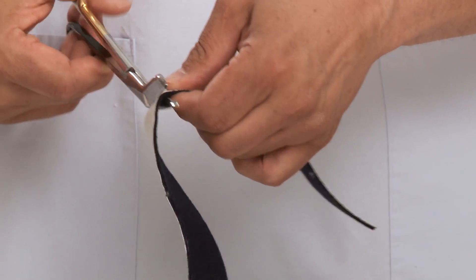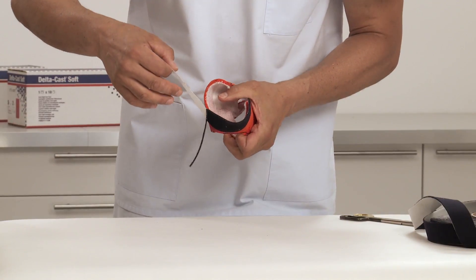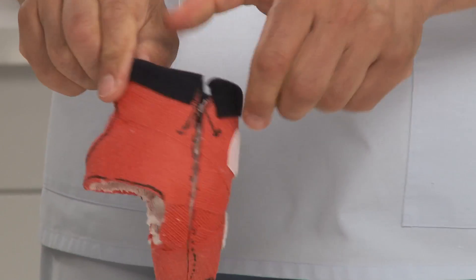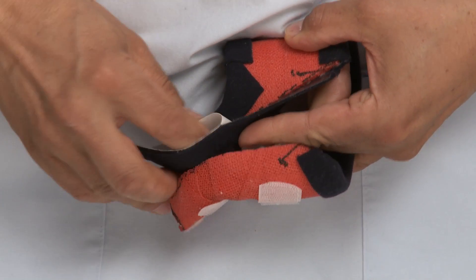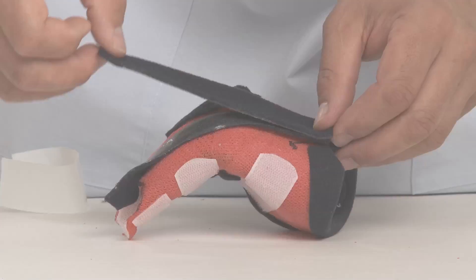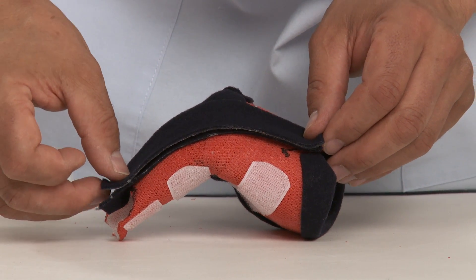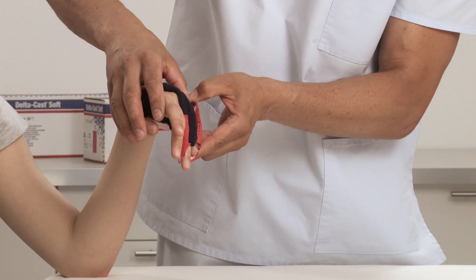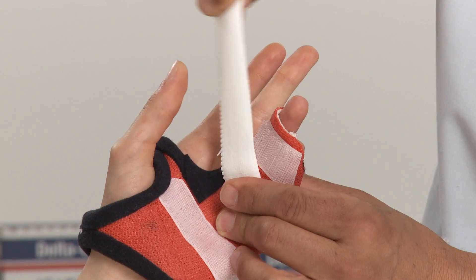Take the cast off again and apply a fleece edger on the distal and proximal cast ends to get soft edges for a comfortable fit. To avoid the skin getting pinched on the long cutting edge, apply an adhesive fleece edger. Place the cast on the hand and attach a stretch loop to secure the cast.